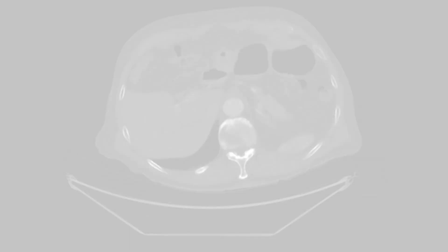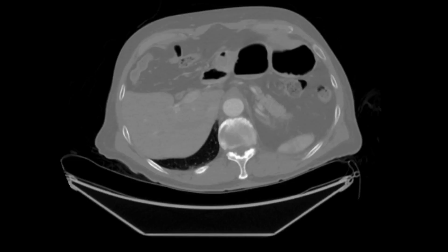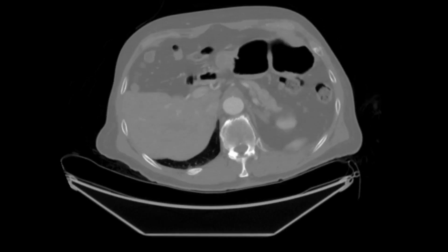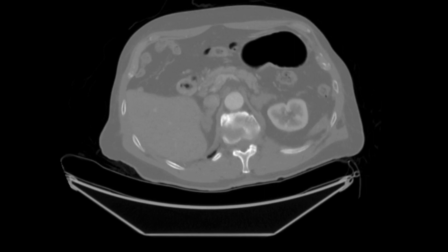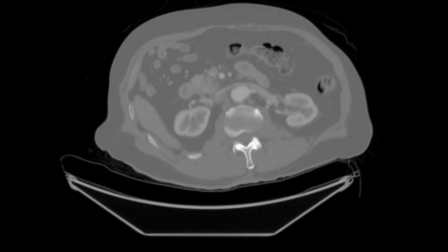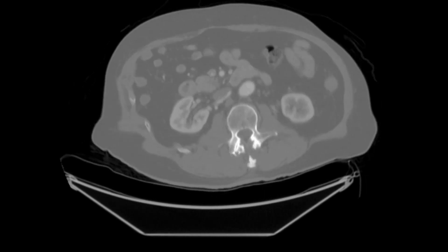Our patient is a 77-year-old gentleman. Shown here is the CTA of the abdomen and pelvis.